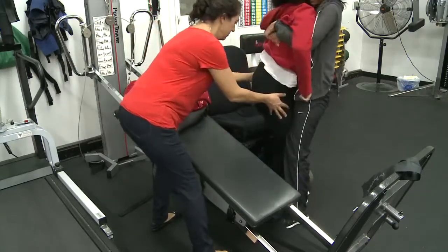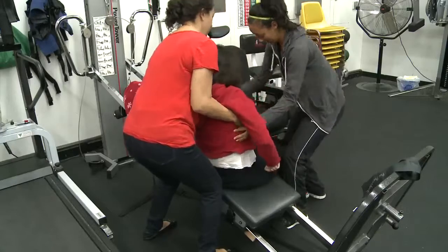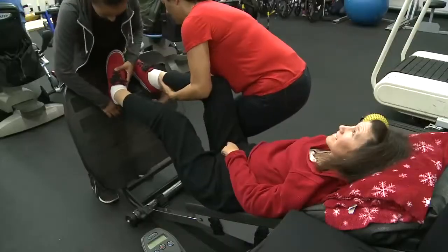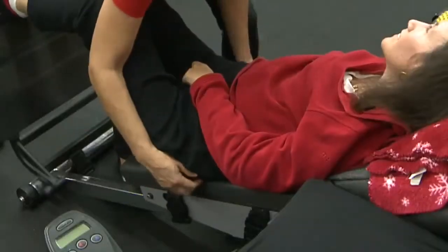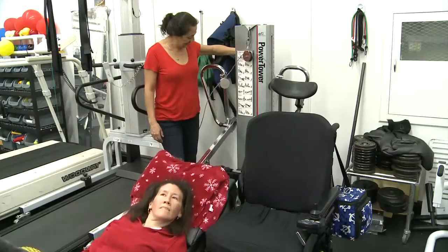Safely transfer the client onto the machine and pivot accordingly, or safely supervise the client onto the equipment. Once the client has their feet on the plate, with their torso centered on the sled, and hips at an appropriate height, you may adjust the angle to the desired level.